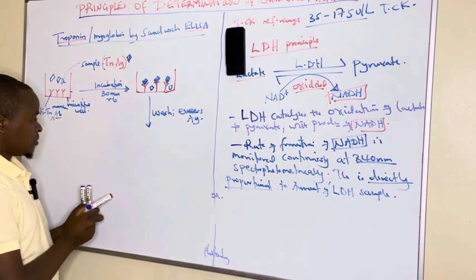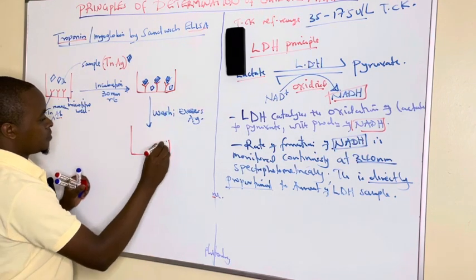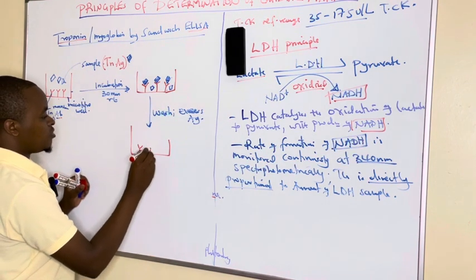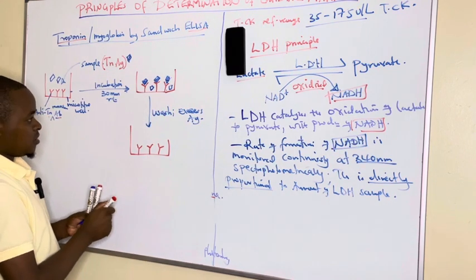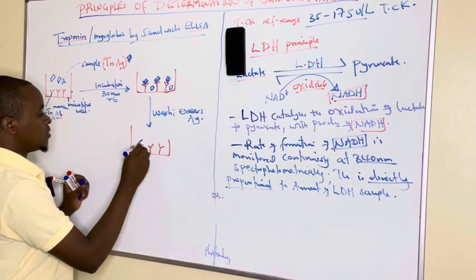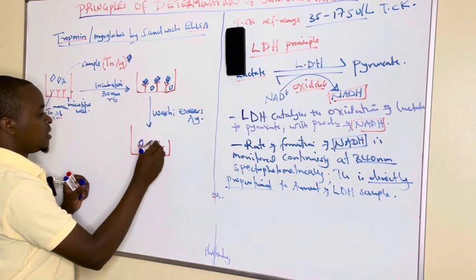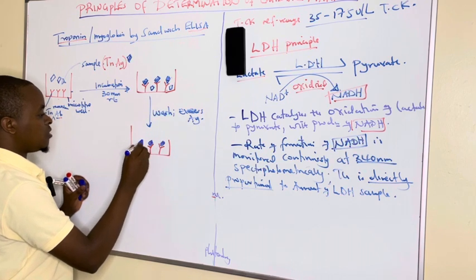After washing, we remain only with the ones which are binding, these antigens that have formed the antigen-antibody complex.